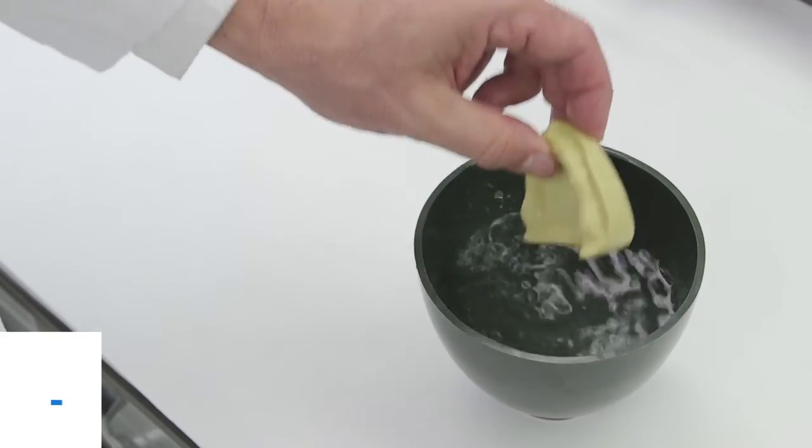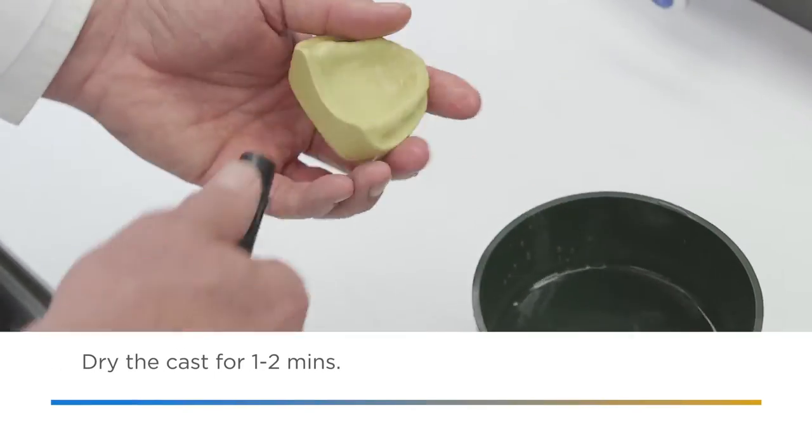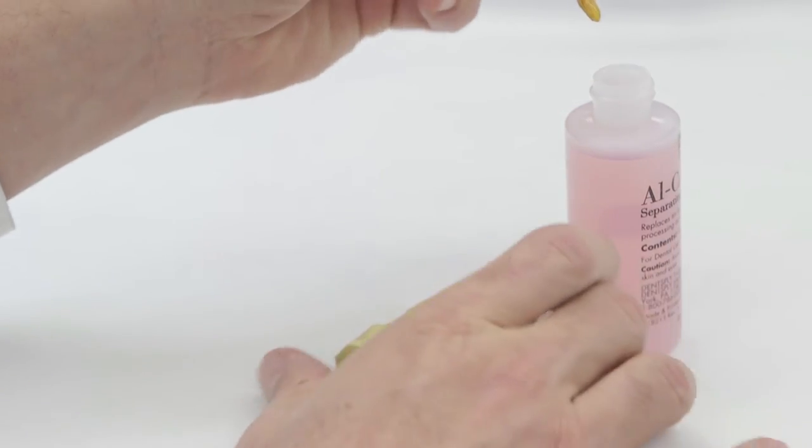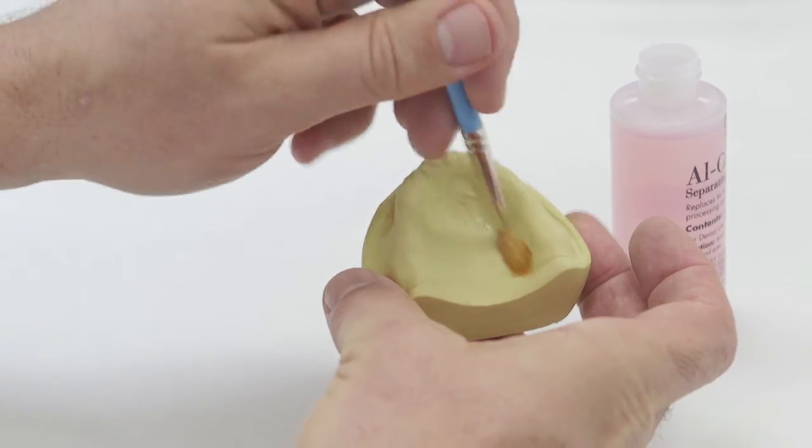Remove the cast from the water and allow it to dry for one to two minutes. Next, proceed to the second part of this step, applying the separator.